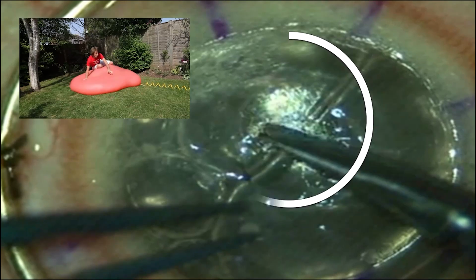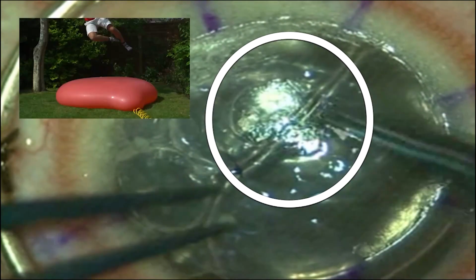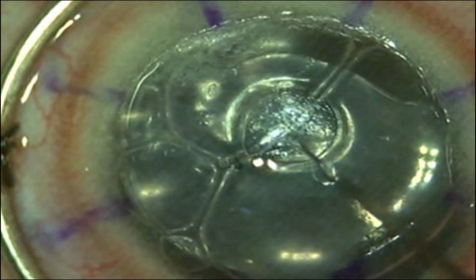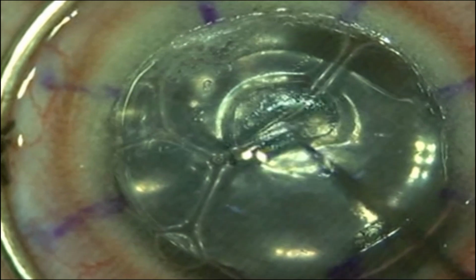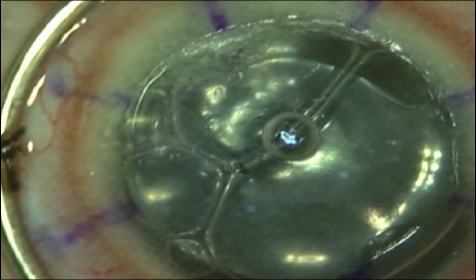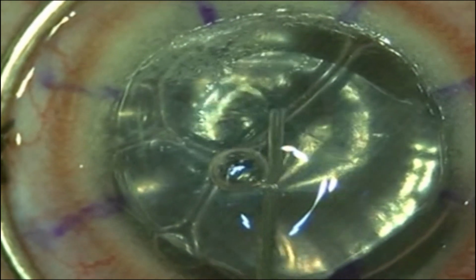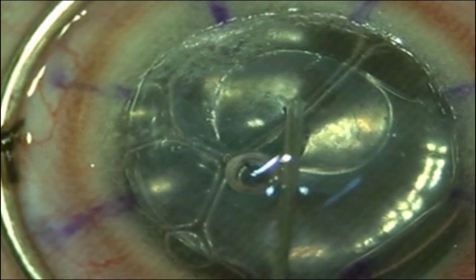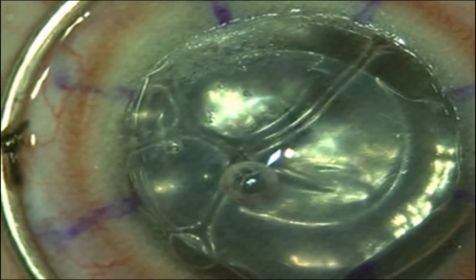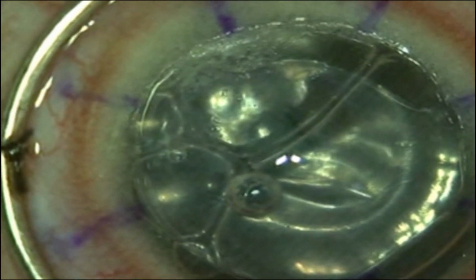At this point, a small portion of the unescaped air in the big bubble was identified. The roof of the bubble was punctured. A viscoelastic was injected into the space to separate the stroma from the Descemet's membrane. Thus, the lost bubble was retrieved.